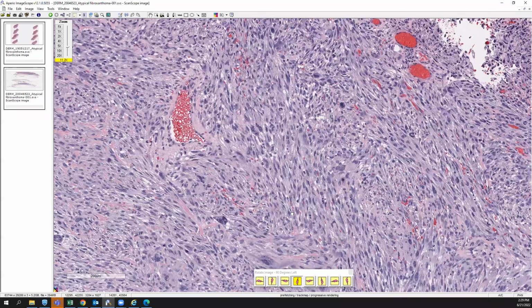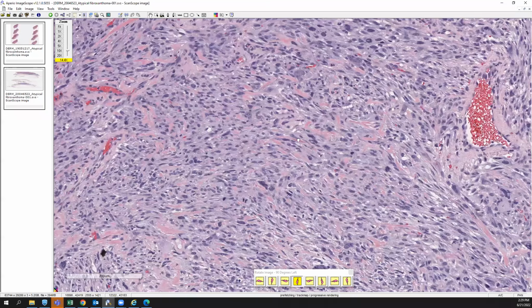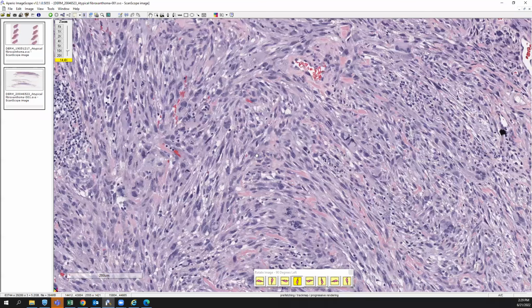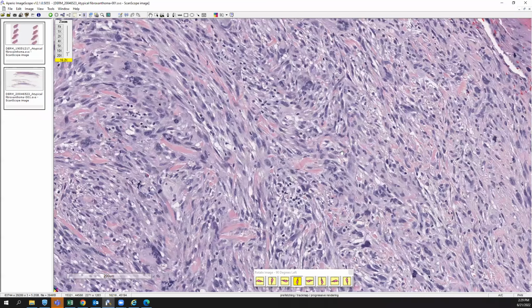Next, you'll want to do melanocytic stains. So you'll want to make sure that this is not some type of spindled melanoma. So you'll do a SOX10. You could do a Melan-A. I like SOX10 because it highlights the nucleus. It's a little bit cleaner. And it captures any atypical neural neoplasms as well. So if SOX10 is negative, then you've excluded melanoma.